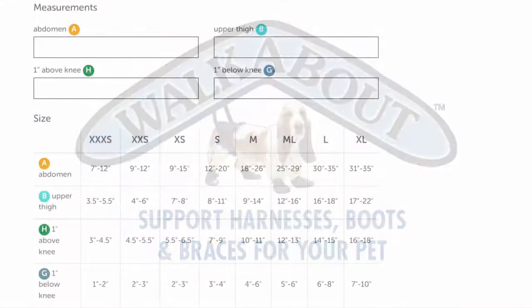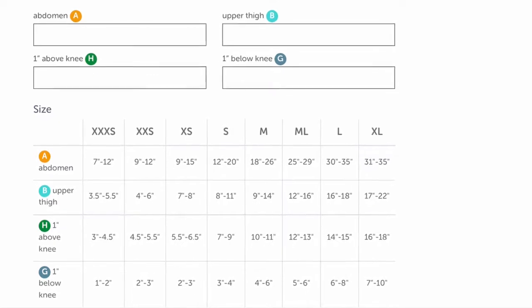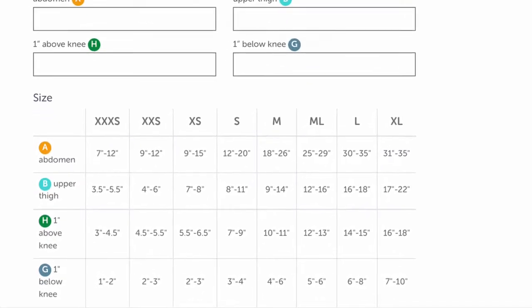Before purchasing your dog's Walkabout knee brace, please take four measurements and select the appropriate size according to our size guide.